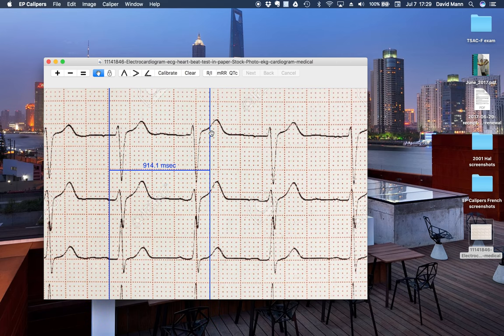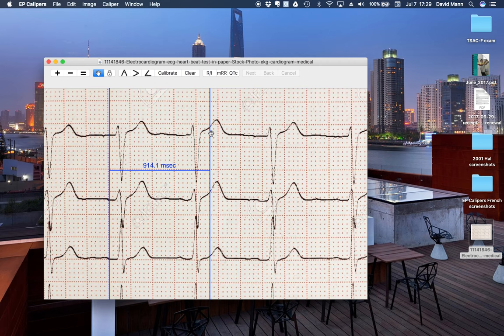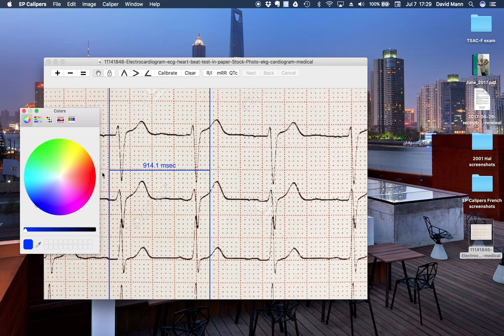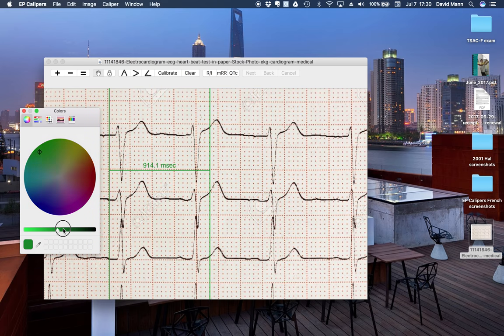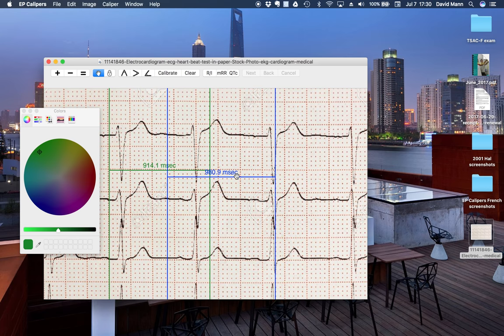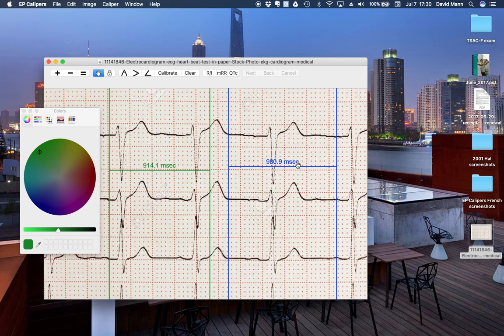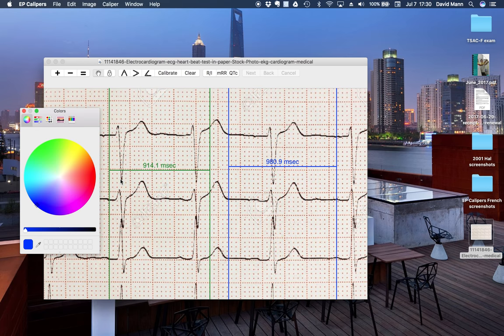Some new things. We can change the colors of individual calipers. So we can make this one green, say. It's pretty ugly. Like so. We can add another caliper and make that one purple, maybe.